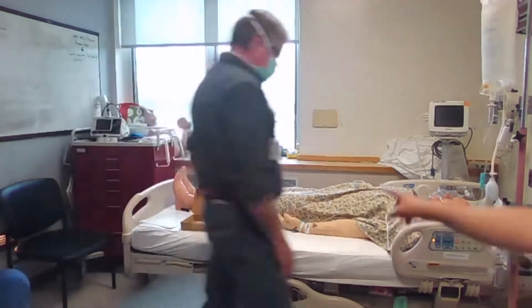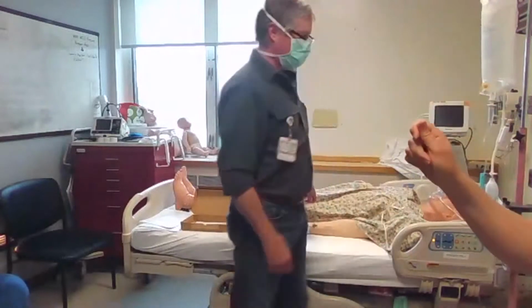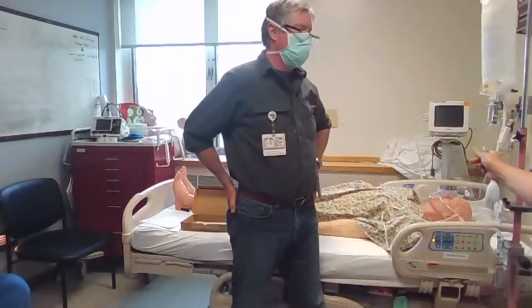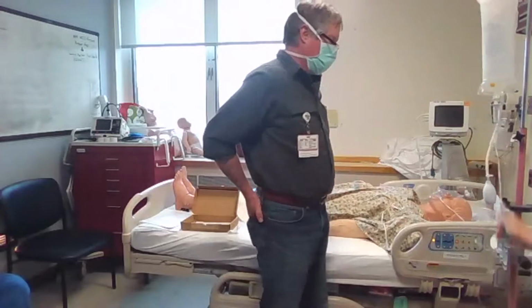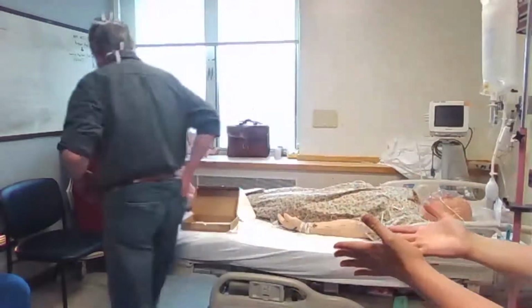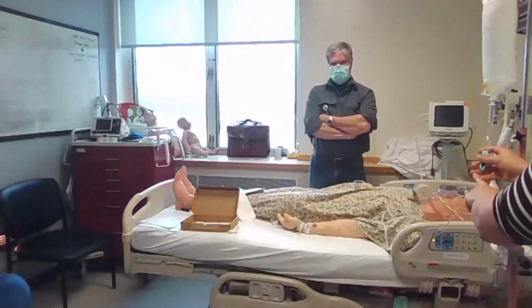And the biggest thing to remember is the stopcocks come closed in the tubing. Closed, okay. Just like in your IV tubing, generally stuff comes closed. Actually, no, it usually comes open. Yeah, so that is not intuitive, but they come closed in this one. So you have to open them so you have a continuous line or else it won't prime. Right, because the stopcocks, when they're stopped to your line, one end or the other, act just like a clamp.